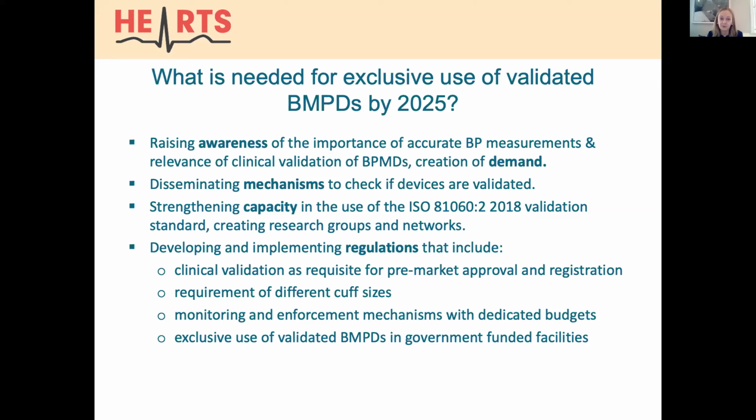The regulation must also include a requirement of different cuff sizes. They must also include monitoring and enforcement mechanisms with dedicated budgets. So it's not only to have regulations, but that those agencies I mentioned have the resources to go and enforce compliance with these regulations. And we have to have exclusive use of validated devices in government-funded facilities. We cannot be spending public money on inaccurate devices.